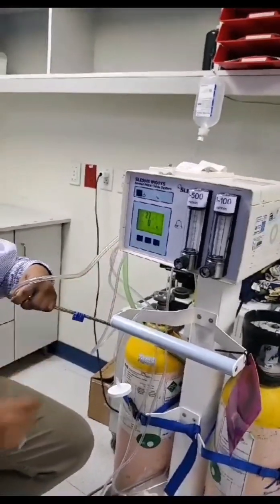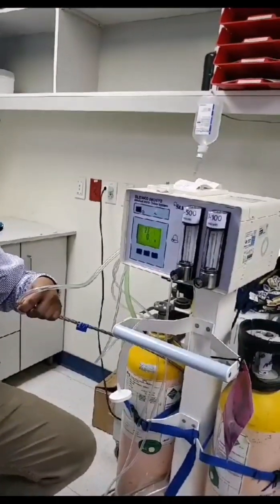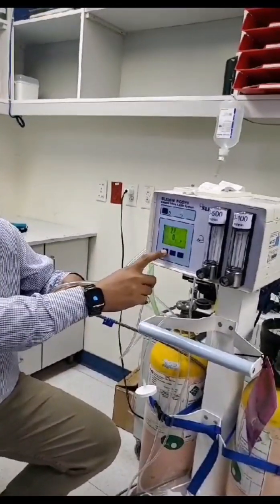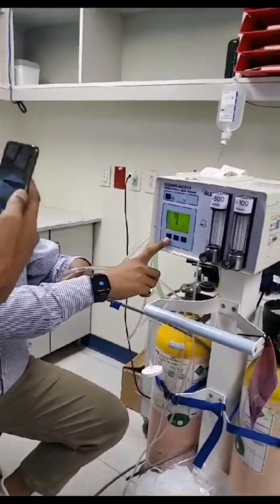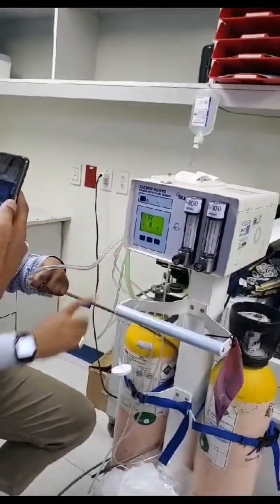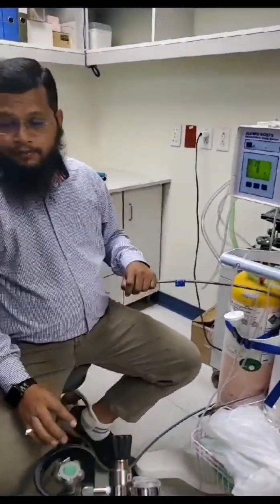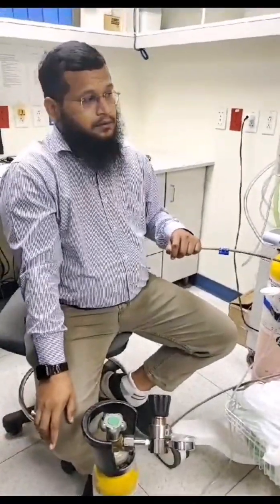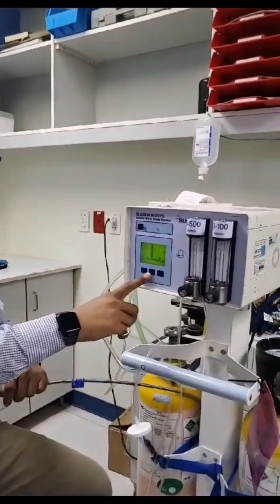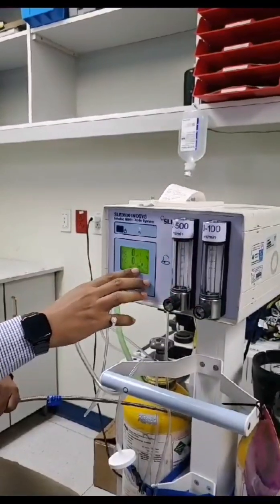Let us start now — once we start it will calibrate. So the NO calibration is done now. The same procedure will follow. We will go to span, then we will select NO2. Just ignore any alarms which come in between.